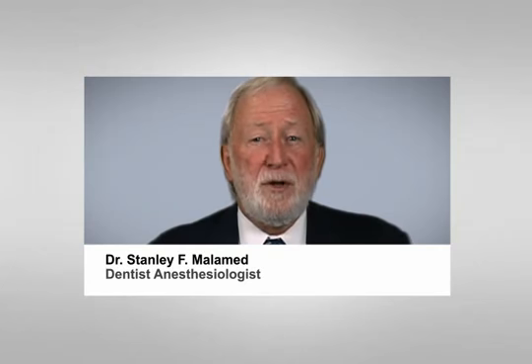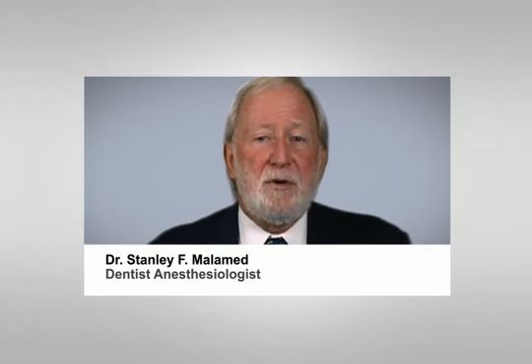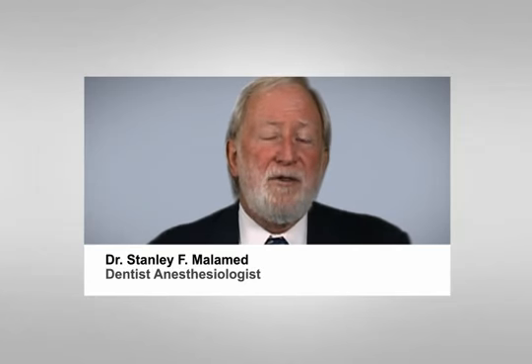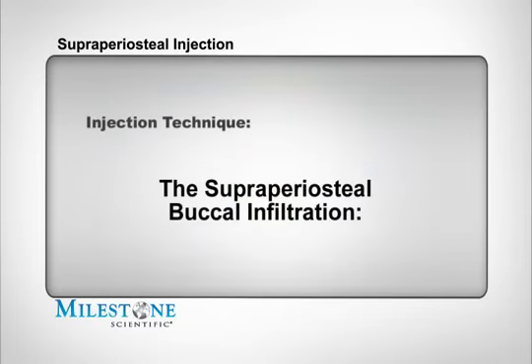The STA system is ideally suited for the administration of traditional injections like the buccal infiltration as well as the posterior superior alveolar nerve block. Let's discuss how to begin. Injection technique. The supraperiosteal buccal infiltration.